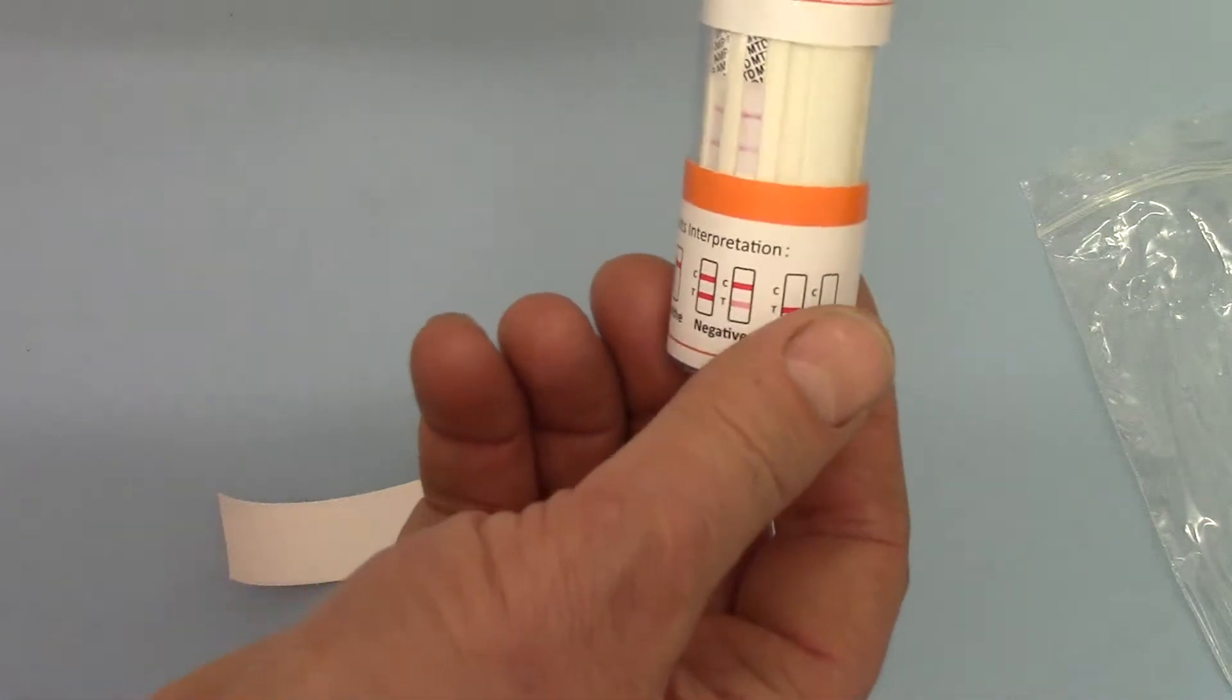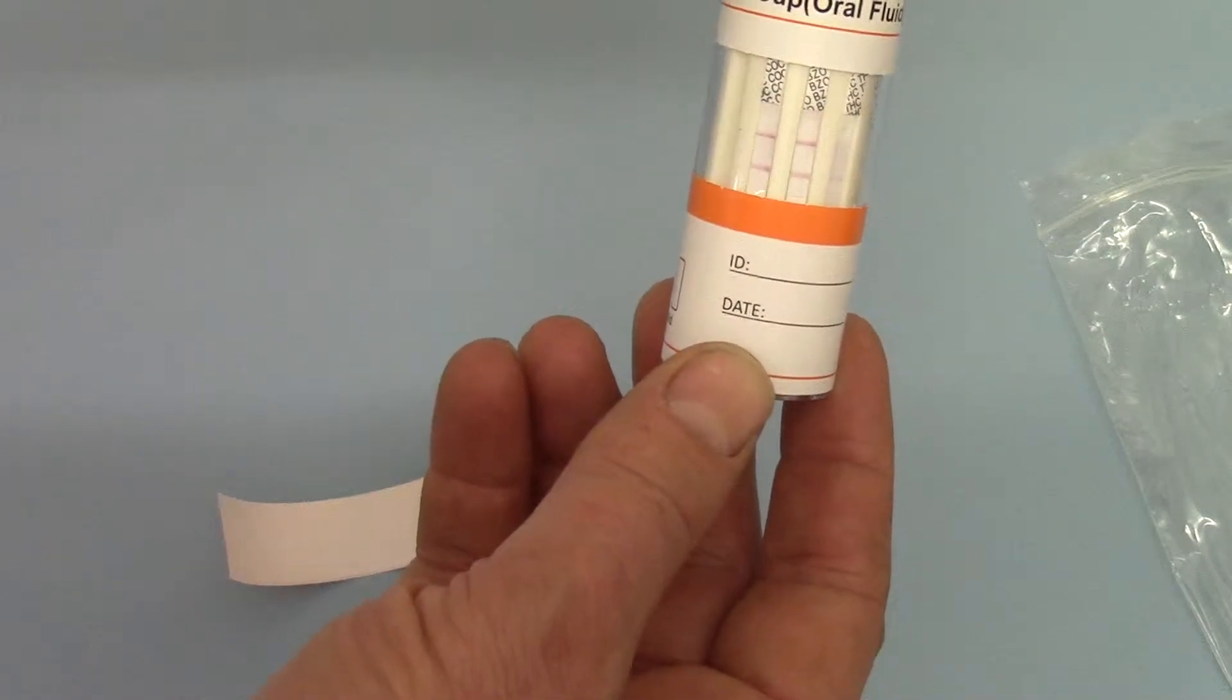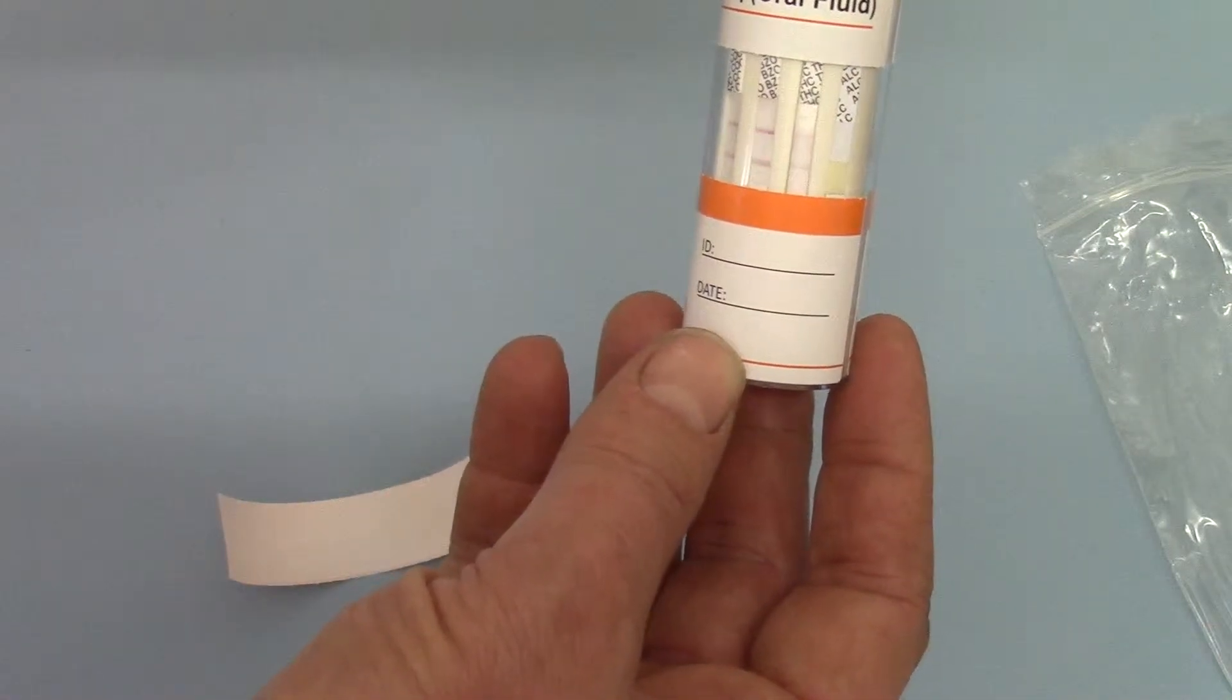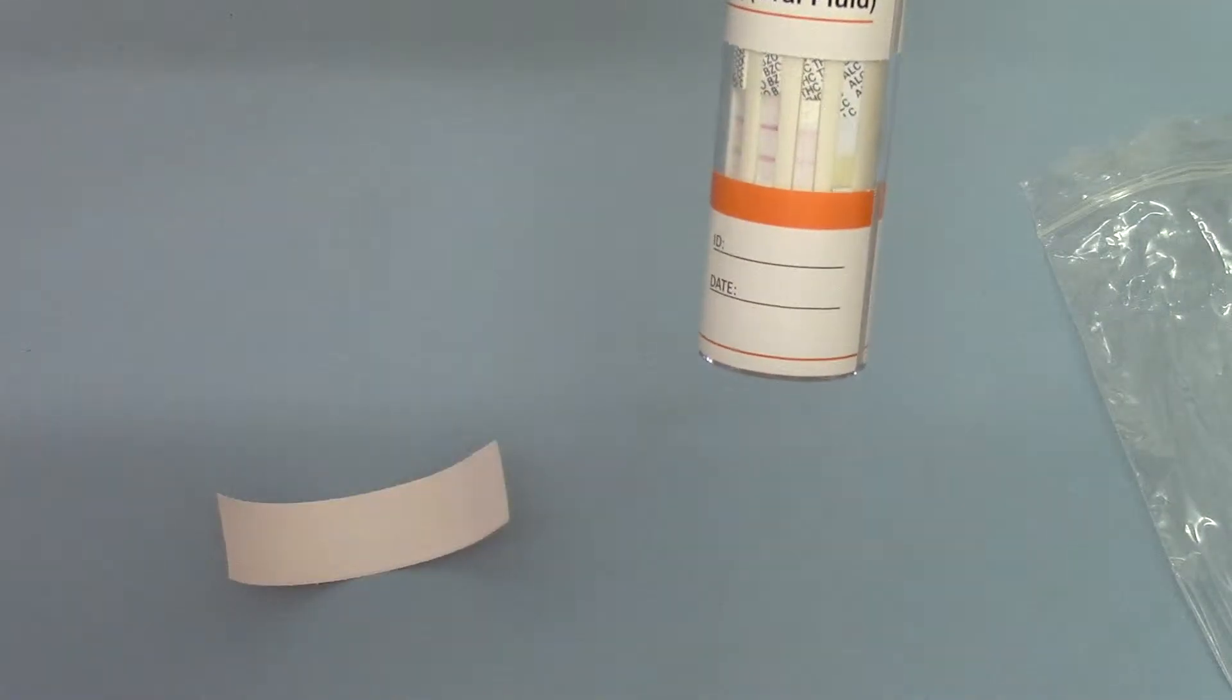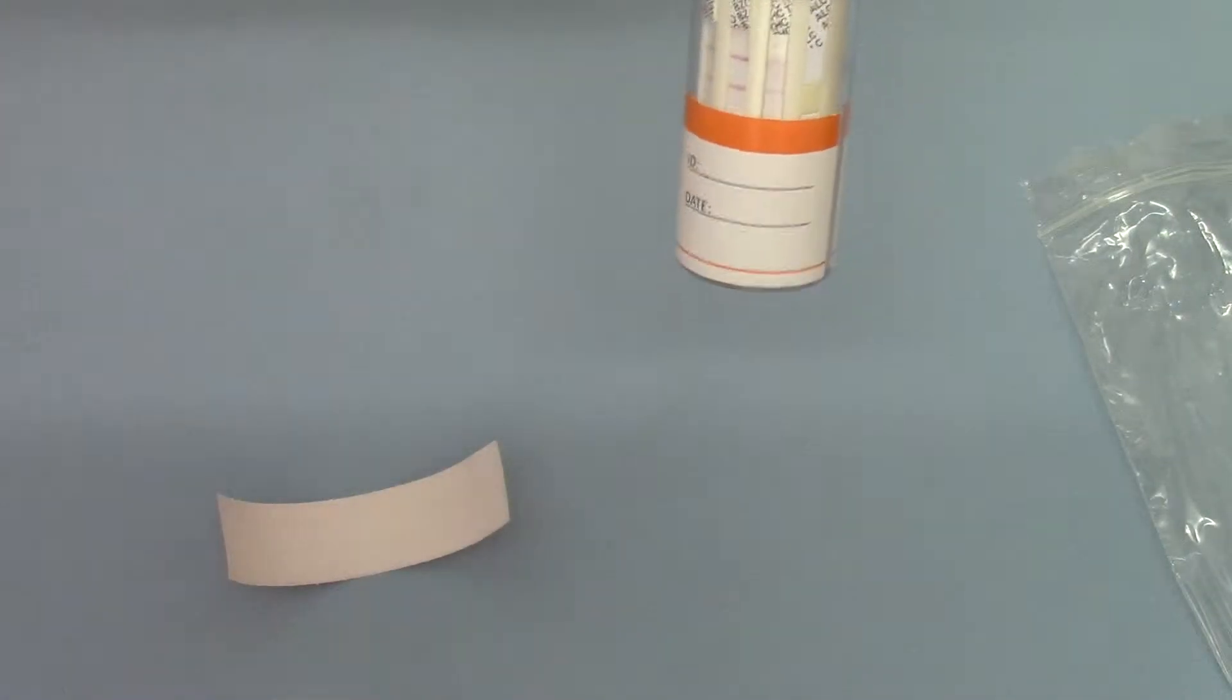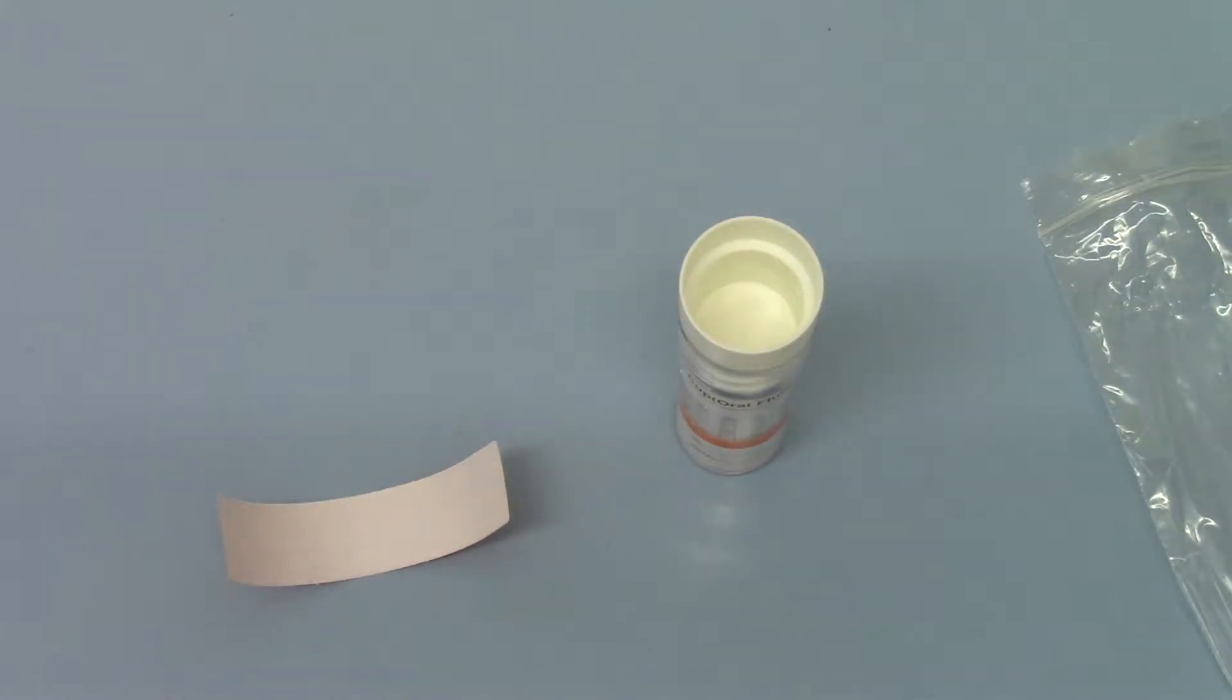It's important with any positive results to wait for the full five minutes developing time for any test line to develop. But you can already see with these that we're getting test lines showing on all. We're just waiting now for that cannabis line, won't be helped by the fact that I'm holding it on an angle. Ideally, these should be placed vertically such as that for the test to run.